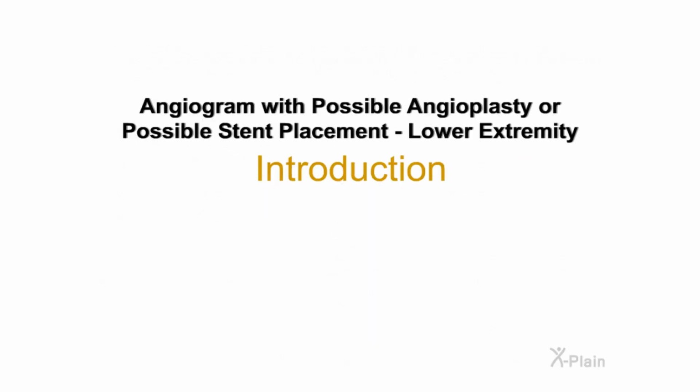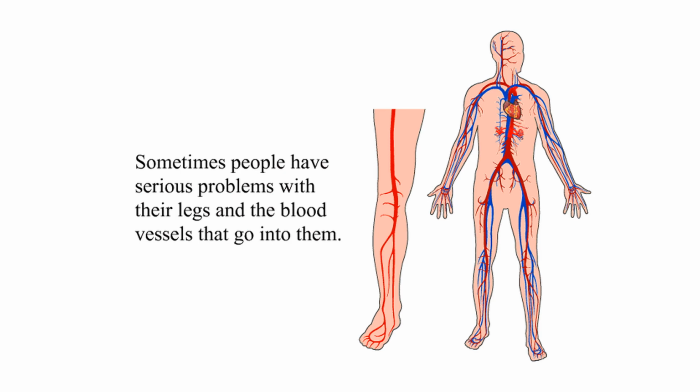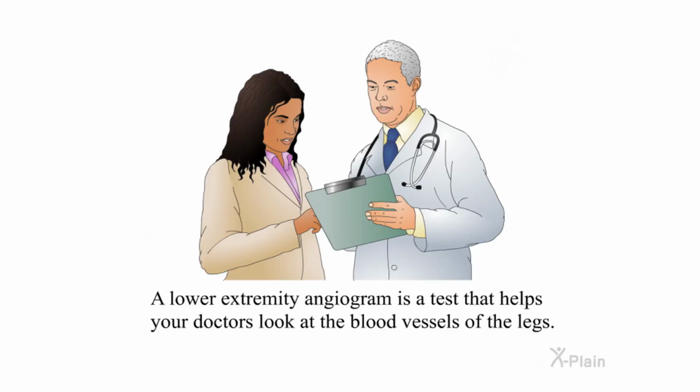Angiogram with possible angioplasty or possible stent placement. Lower extremity. Introduction. Sometimes people have serious problems with their legs and the blood vessels that go into them. A lower extremity angiogram is a test that helps your doctors look at the blood vessels of the legs.